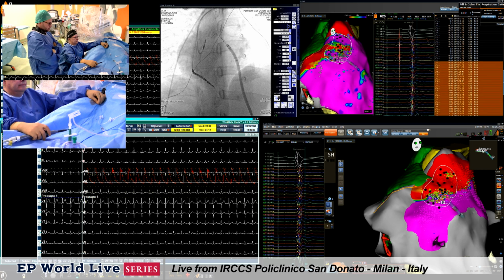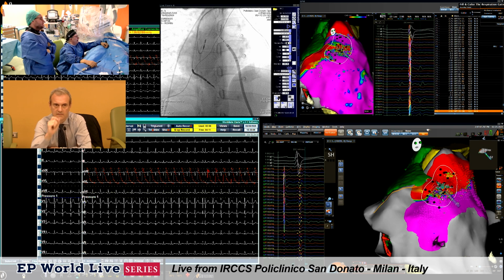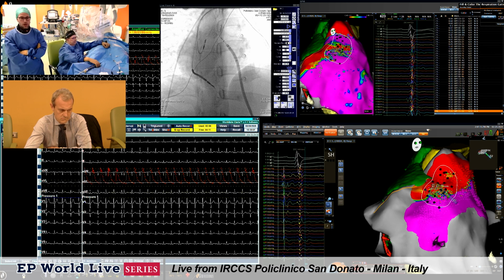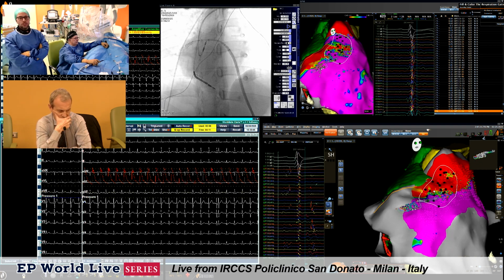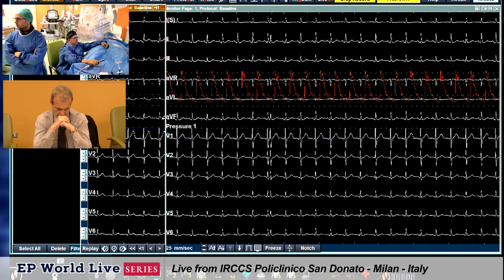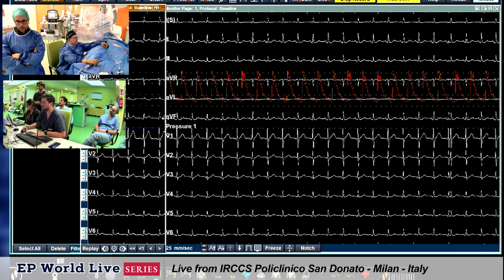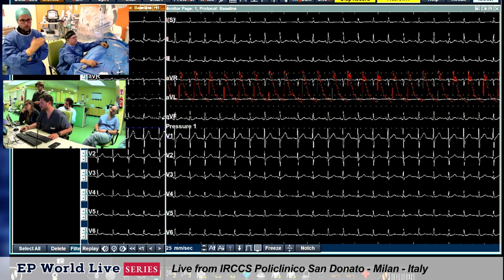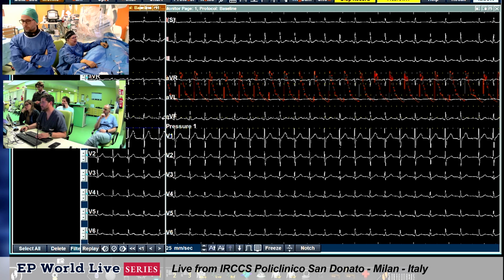Indeed, we have a question about what ECG leads show the most evident changes after ablation. All of the previous ECG abnormalities that we had in the infralateral leads, now they are not showing anymore the early repolarization pattern. Actually, if you look at D2 and D3, and V6, you see that they don't have anymore this kind of late slurring, and ST elevation. See, it's the epicardial electrogram, completely normal.